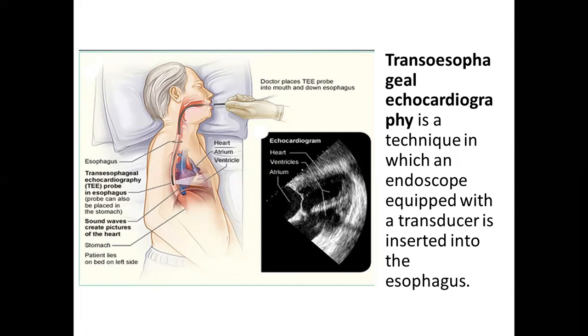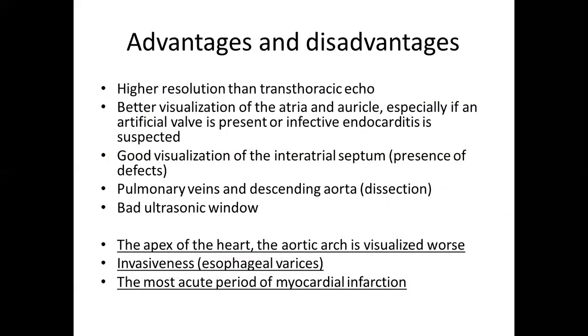So yeah, in patients who have atrial problems, one of the options is to make transesophageal echocardiography. The problem here is that because of the left main bronchus, we cannot see the arch of the aorta. So we should at least make suprasternal notch imaging of the arch of the aorta, because some pathologies such as aortic coarctation or aortic aneurysms may be located very close to the arch of the aorta. So we should check this also.